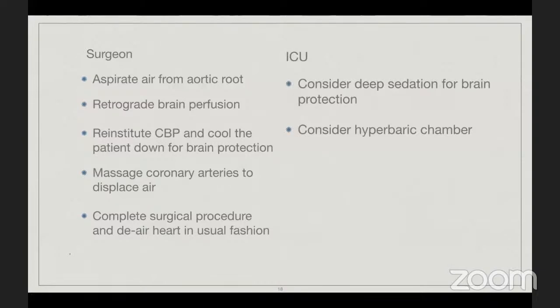You said for like 2 minutes, but this is very crude. Do you have any other ideas of how to know that you flushed most of the air from the brain? Maybe I can see air bubbles in the vent. Exactly. If you have the open aorta vent, you will see the bubbles coming out until you see clear. Even if it takes 10 minutes, 2 minutes is just a number.